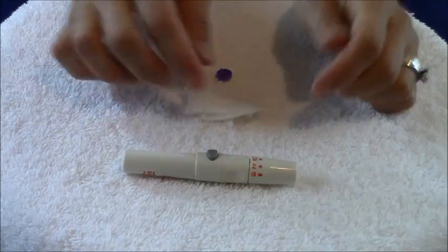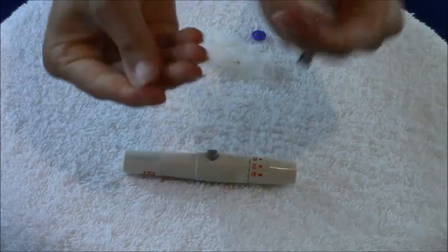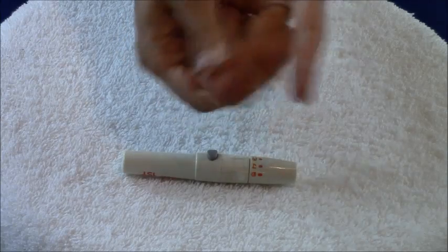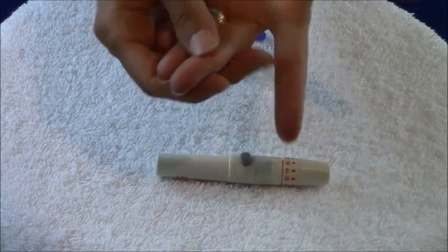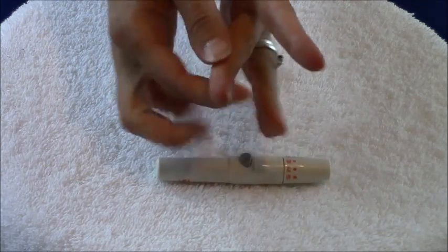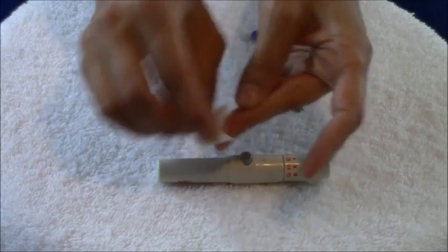With our lancet ready, pick a fingertip — any fingertip will work. Rotate those fingertips out because they can get really sore. Really massage that finger to get blood flow to the tip, because that gives you the best specimen. Then clean the area with an alcohol prep to get any germs off.